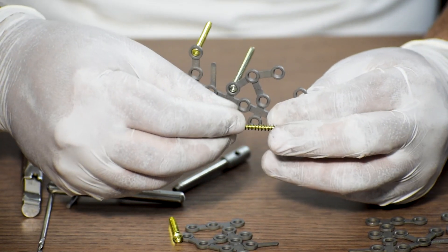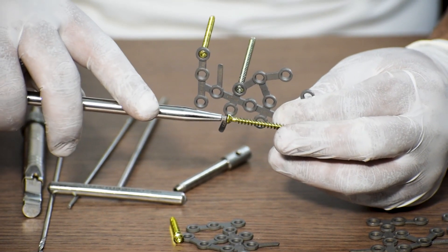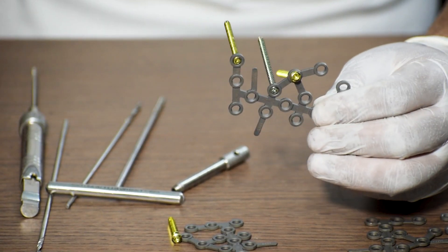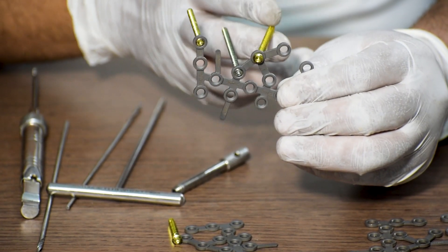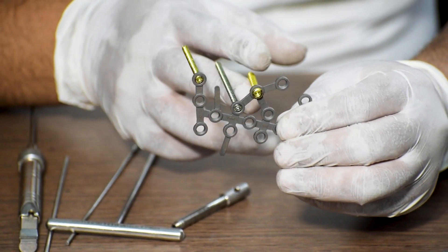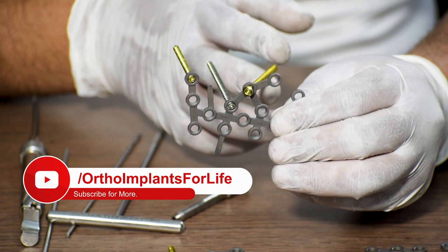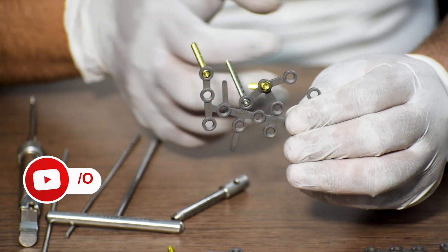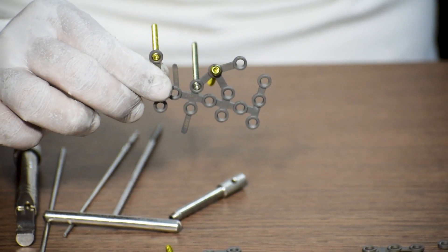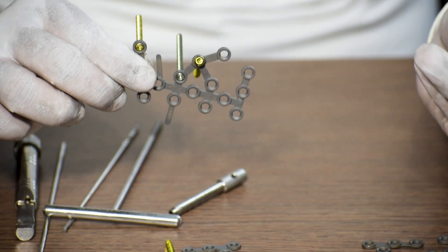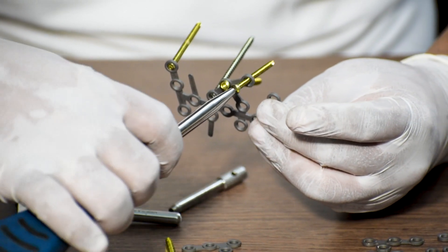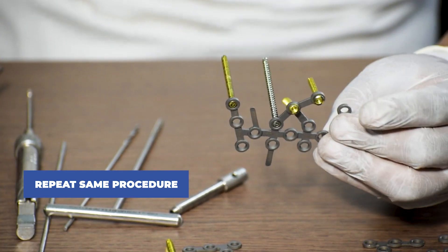If advised by surgeon, we will also provide 4 mm full thread cancellous which can be again fixed to the plate with the help of a 3.5 mm screwdriver. The difference between the locking cancellous and a full thread cancellous screw is, locking cancellous screw gets locked in both the bone and the plate. And full thread cancellous only gets locked in the bone and not in the plate. Now we repeat the same process to fix as many screws as per the surgeon's call.